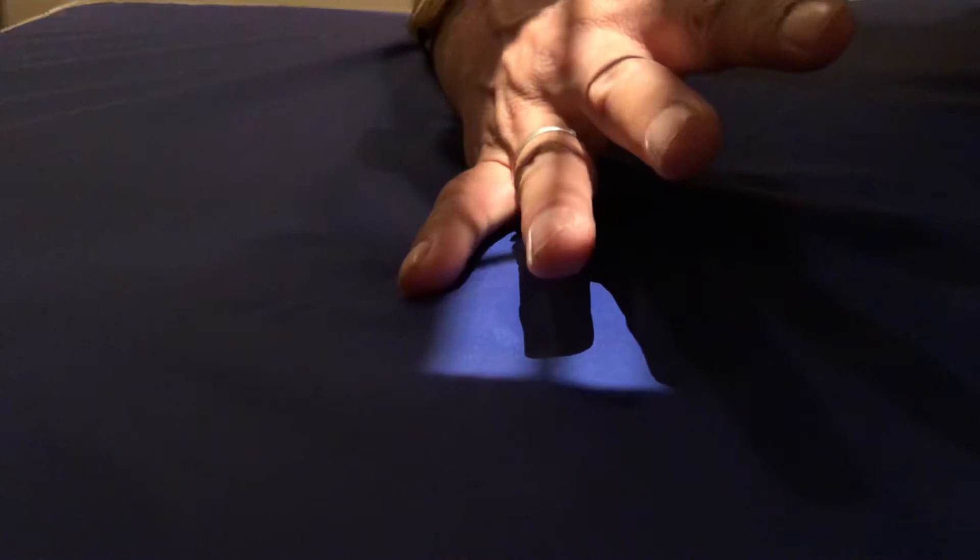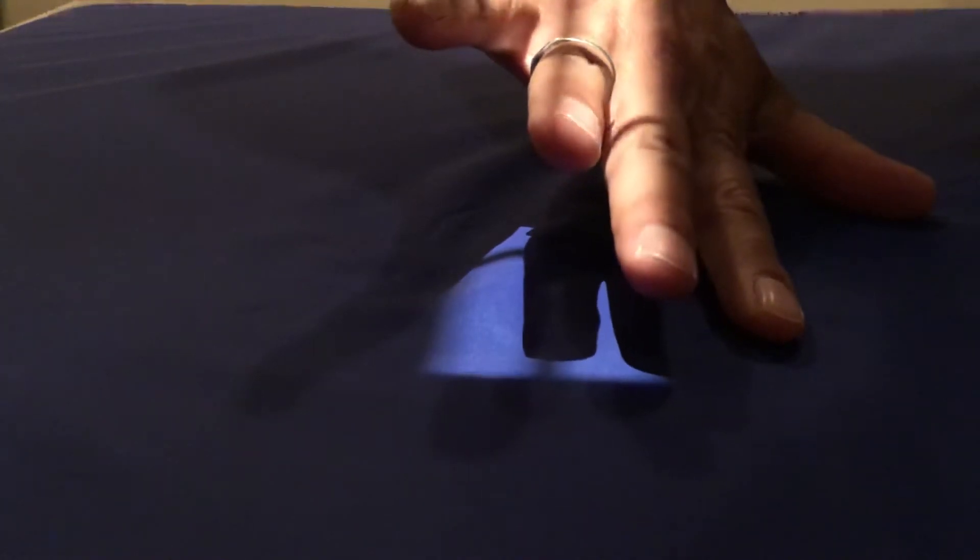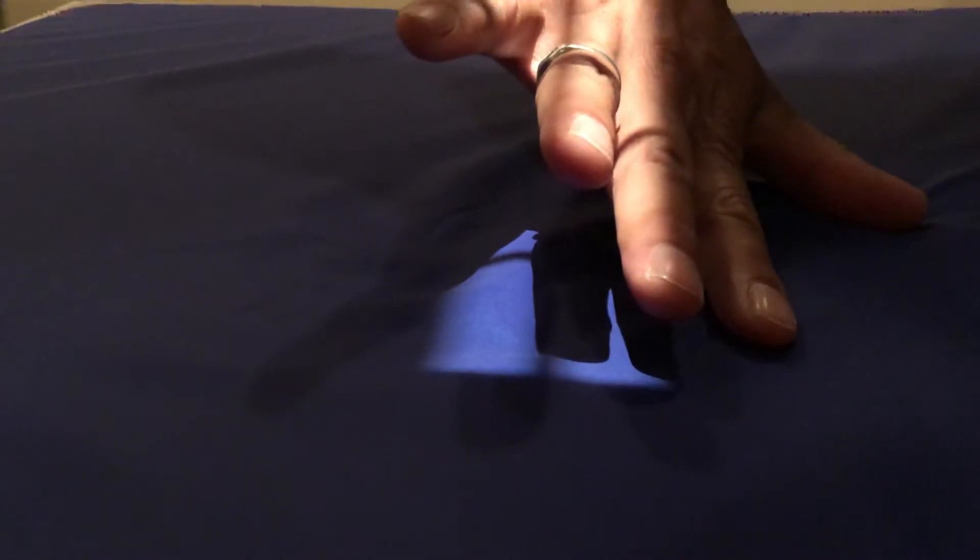The oblique is going to be 45 degrees up, and that'll look like that. The other oblique is going to be this way — try to get it 45 degrees.